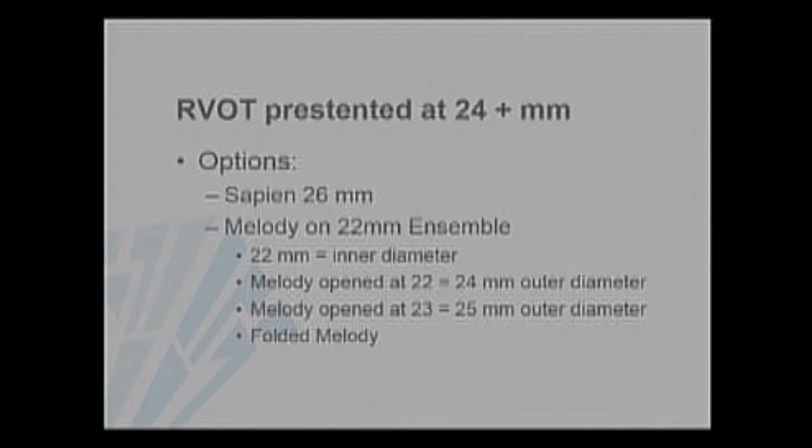So pre-stented 24 millimeter plus. Now, of course, there are options. As Andreas mentioned, they have the 26 millimeter or Melody 22 millimeter, and maybe go to enlarge it. It will enlarge to 24 millimeter outer diameter.